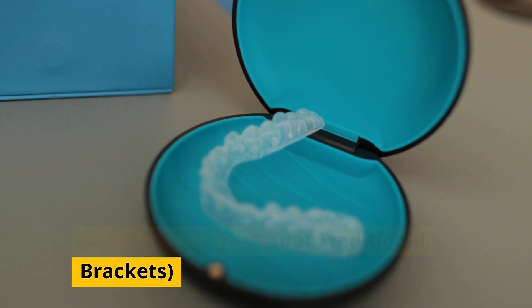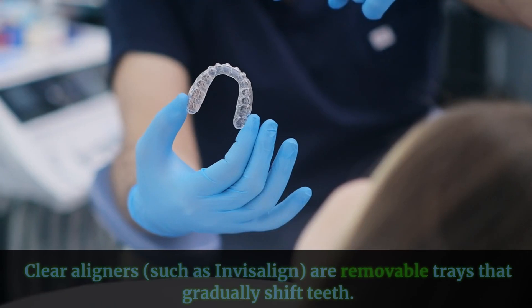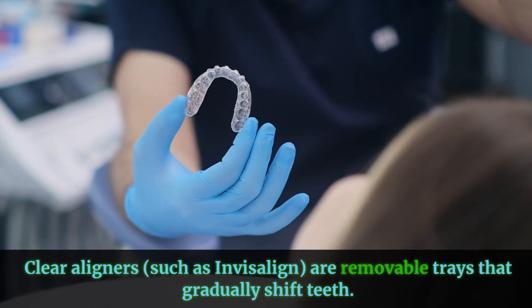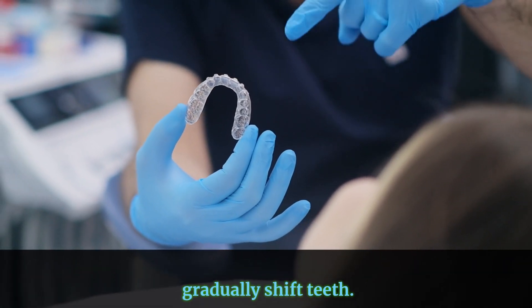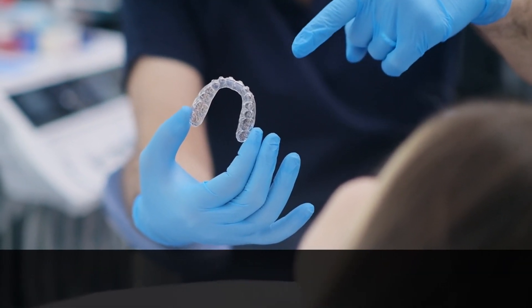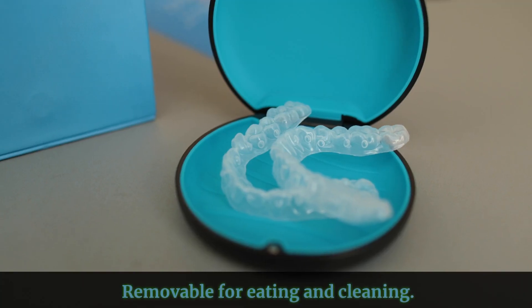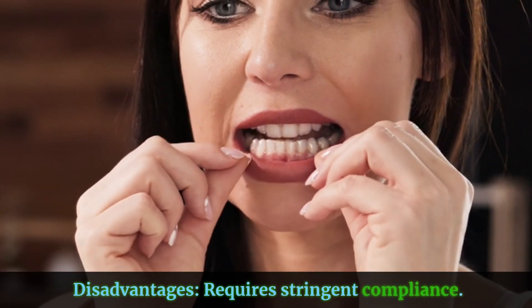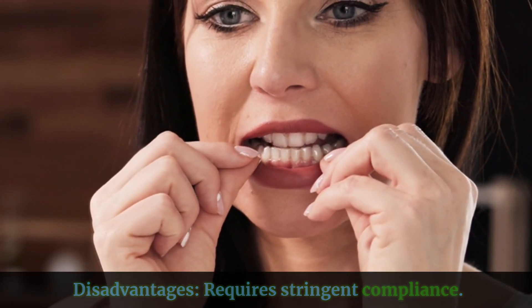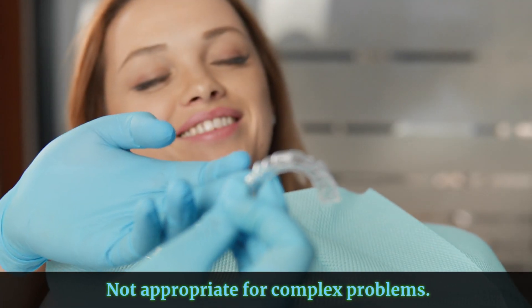Clear aligner trays are not traditional brackets. Clear aligners, such as Invisalign, are removable trays that gradually shift teeth. Advantages: virtually invisible and removable for eating and cleaning. Disadvantages: requires stringent compliance and not appropriate for complex problems.